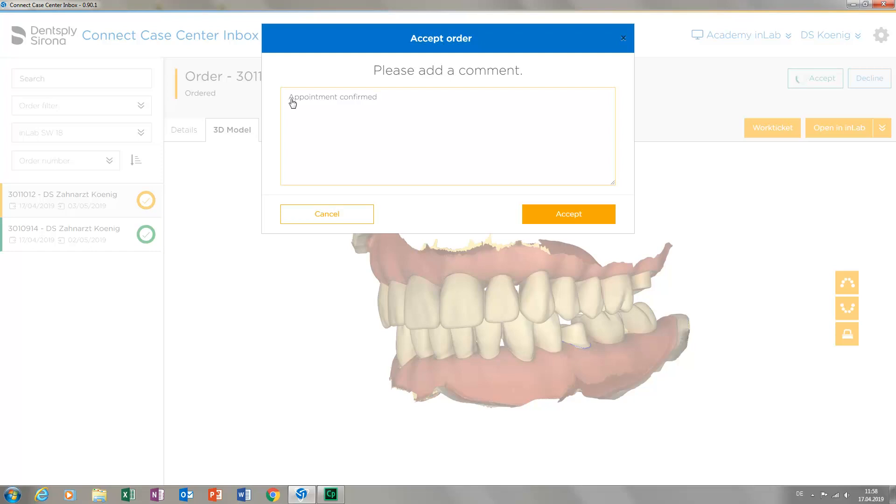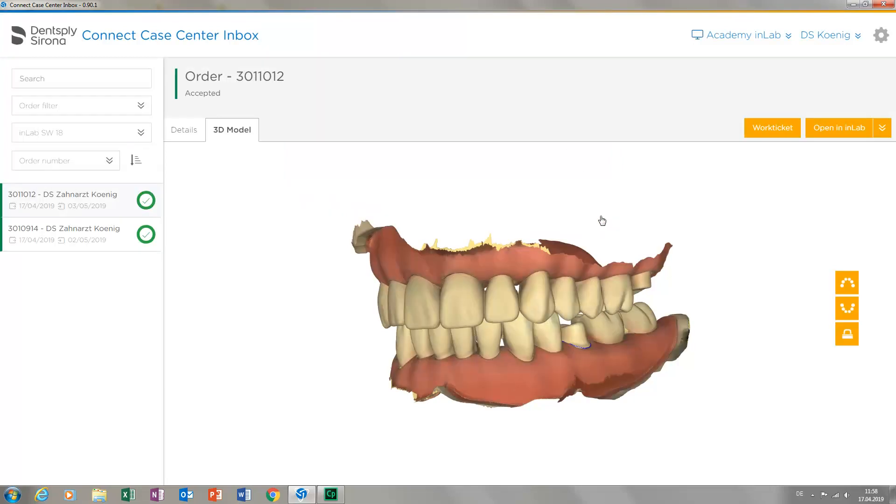By tapping accept again, the case is fully accepted and the treating dentist will receive a notification regarding this status. As you can see, the current case is now displayed with a green circle and a check mark.